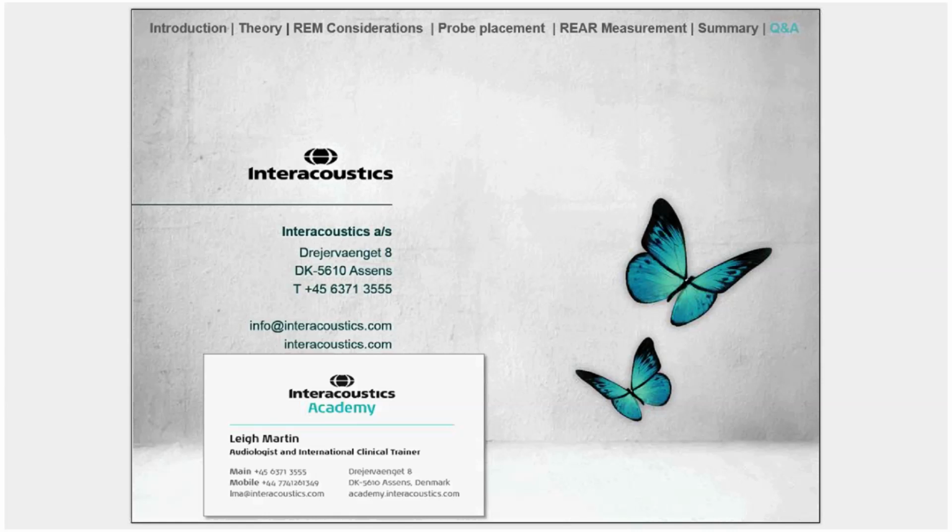I guess the other reason why patients can hear their own voice is a phenomenon called amp occlusion, where you're providing too much low frequency gain. So I guess the way to get around that, of course, would be to make sure that you haven't over amplified the low frequencies. So that way you'll be looking at your real ear aided response or insertion gain measurement and making sure that that's matching target and not over amplifying. So a combination of the two should be able to give you insight into whether or not occlusion is occurring and the patient will be overhearing their own voice.